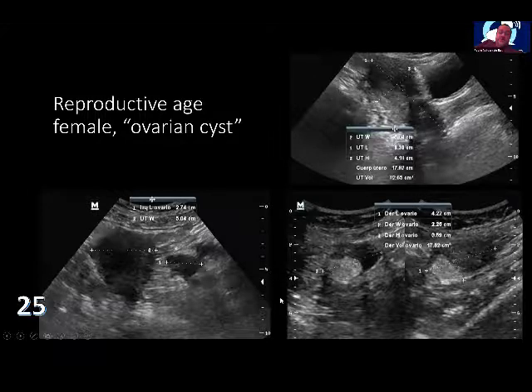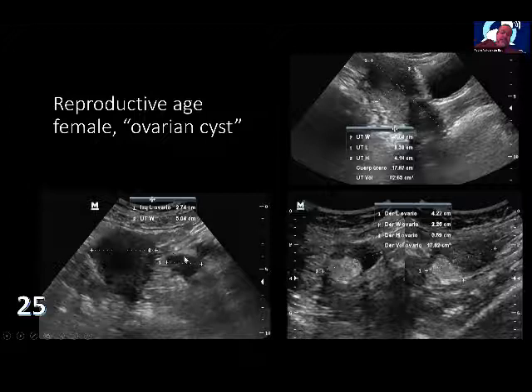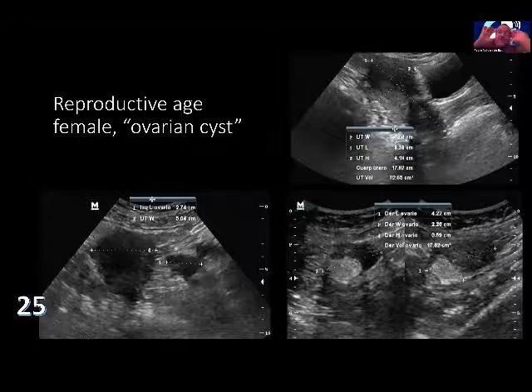These are the slides of the same patient showing the uterus in a transverse view on the uterine axis, almost left ovary. Remember, what is on the right side of the screen is the left side of the patient, because we are looking at the patient like this.